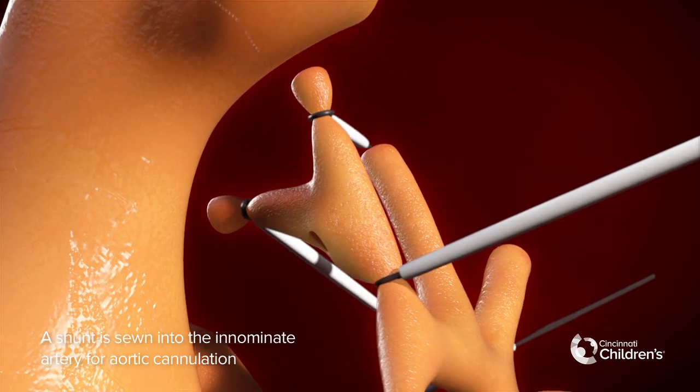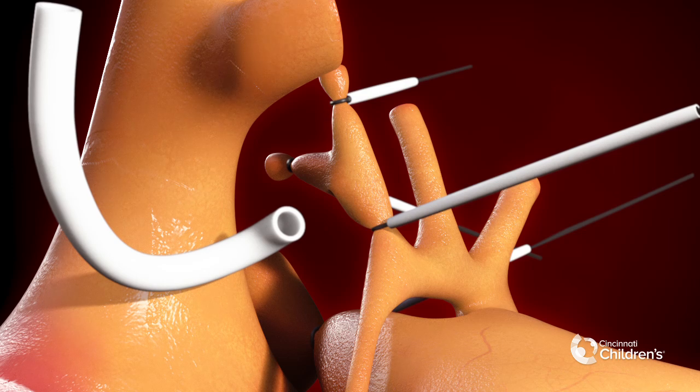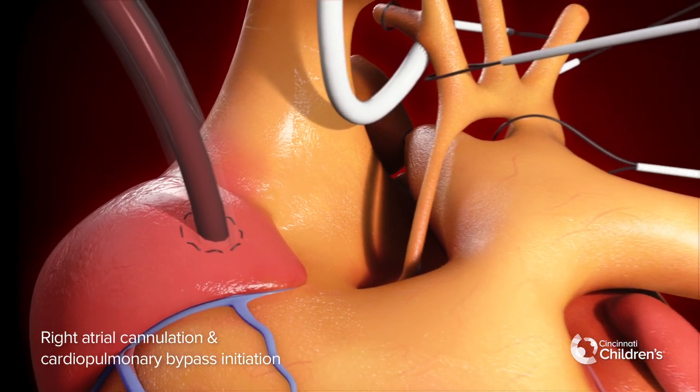The shunt is sewn into the innominate artery for aortic cannulation. Right atrial cannulation and cardiopulmonary bypass is initiated.